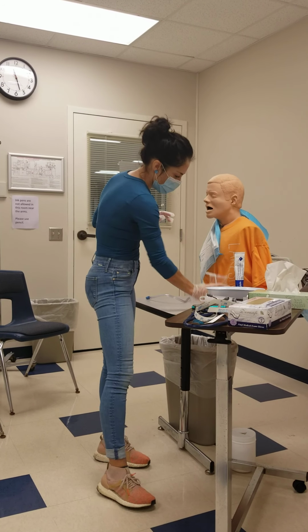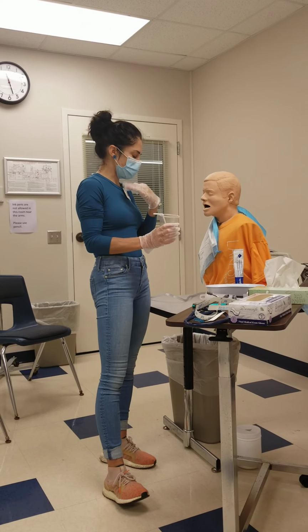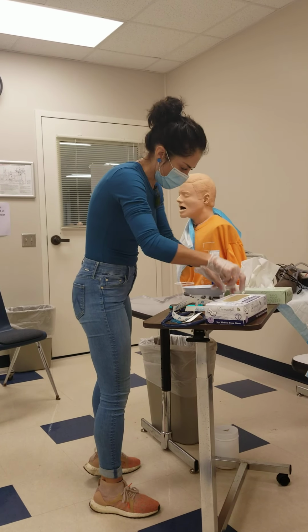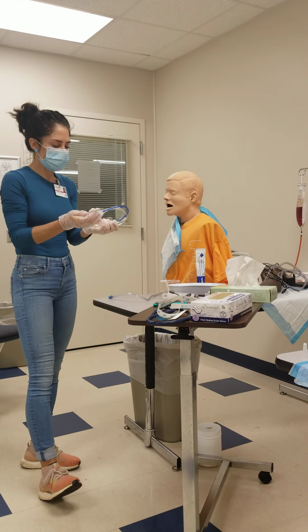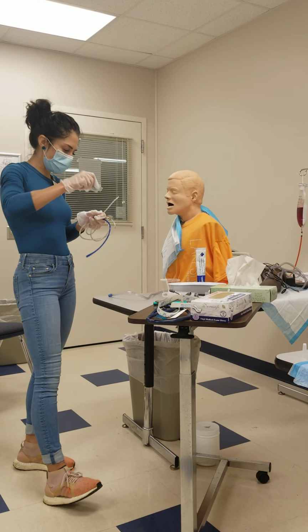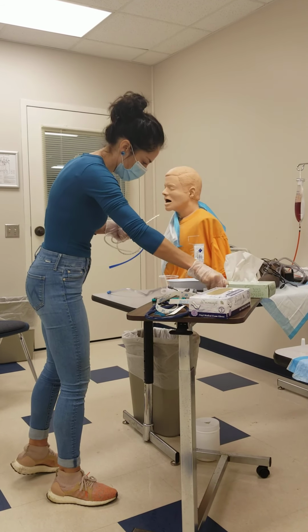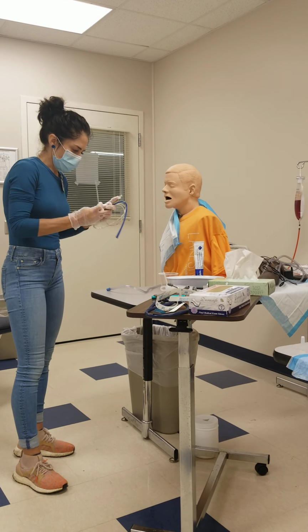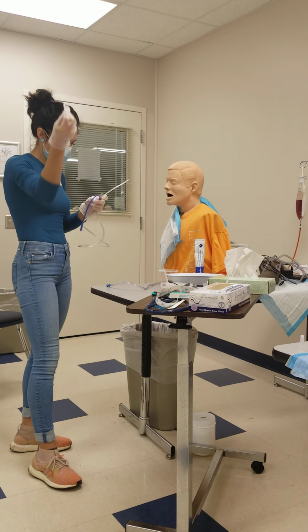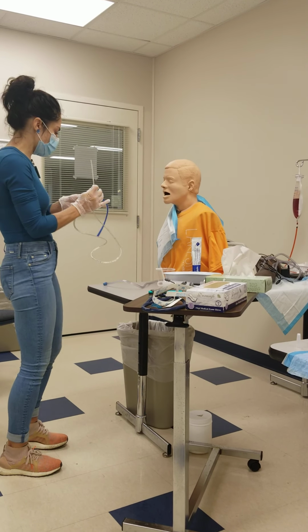Okay, and I've got a cup of water, which he will be drinking once I pass the tube past a certain point. I'll be having him take sips of that. So at this point, I've got my tube, I've got where I need it to go. I've got my lube, because if we don't use lube, it will be very difficult to go down. And then we also want to make sure that we either have a syringe or our cap, otherwise the contents are going to spill all over the place.